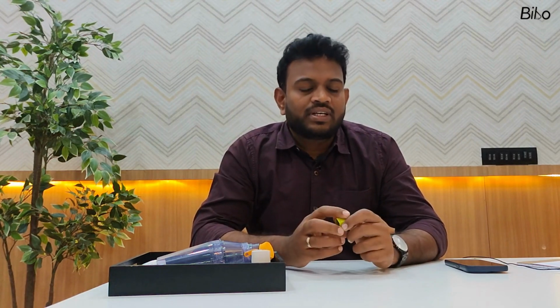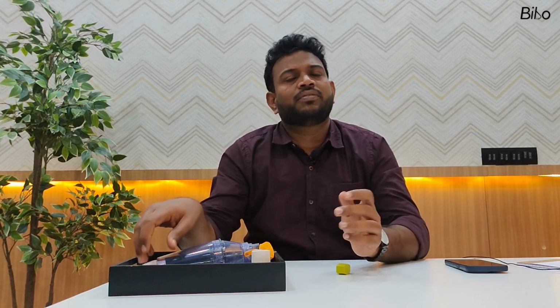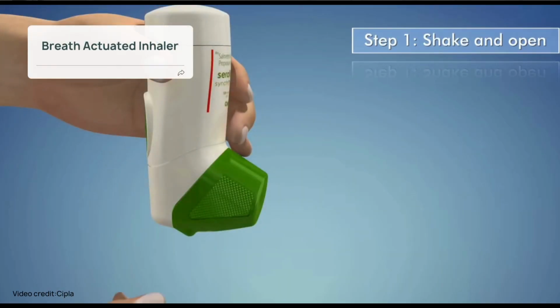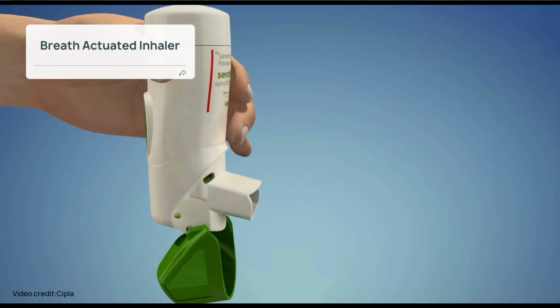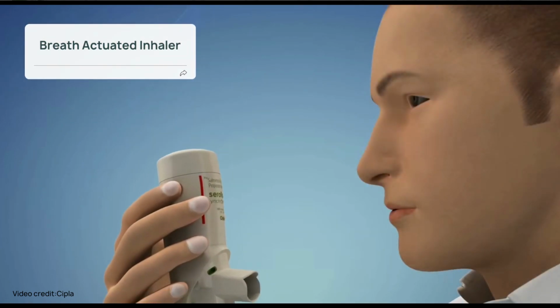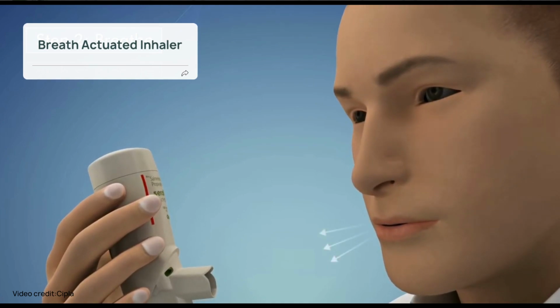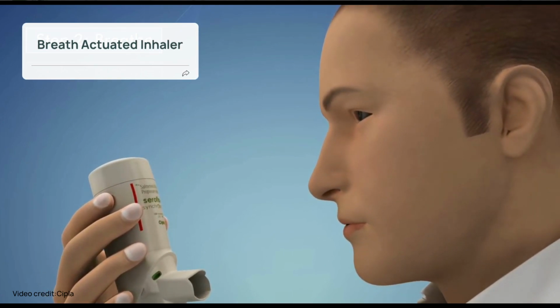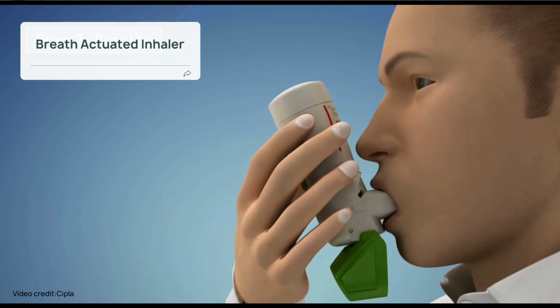The breath-actuated inhaler, which I've spoken about, is also a similar type of inhaler, looking similar to an MDI, where we don't require any spacer and we don't need to press the canister either. It is already pressurized and breath-actuated by name. The moment the patient takes a deep inhalation, the drug will be delivered from the mouthpiece into the lungs. The advantage of the breath-actuated inhaler is that hand and breath coordination is not required.